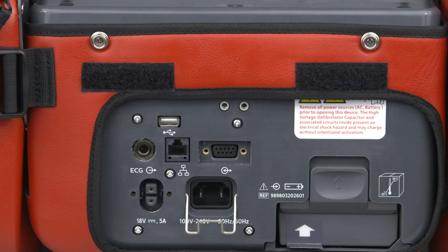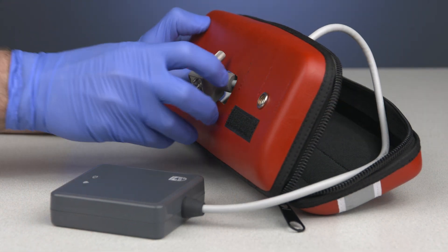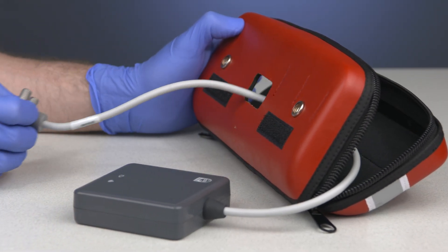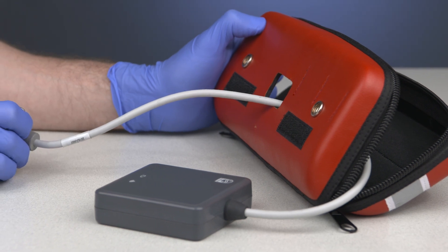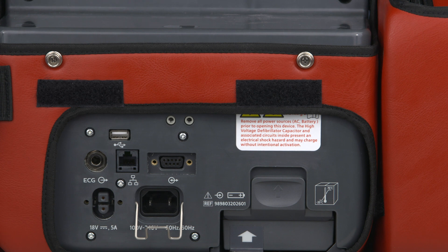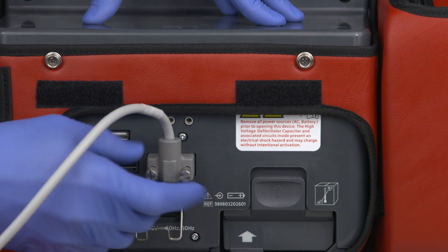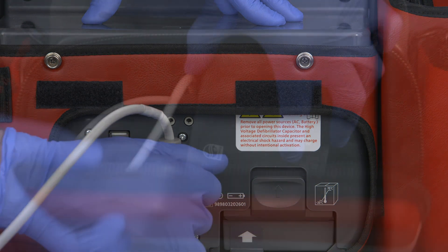The next step is to connect the Communication Module to the HeartStart Intrepid — it connects on the back of the device. If your device has a carry case, feed the Communication Module cable through the opening in the rear or side pouch. Attach the cable to the connector on the HeartStart Intrepid and tighten the thumbscrews to ensure a good connection.